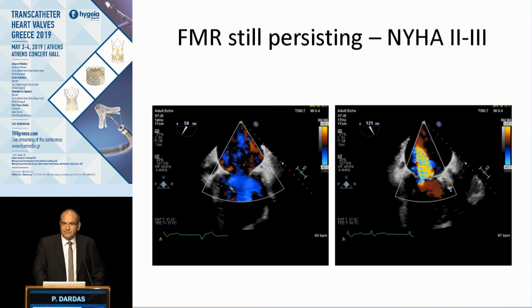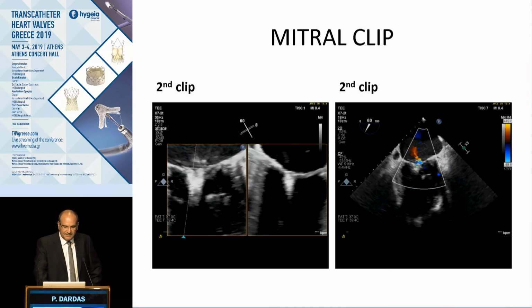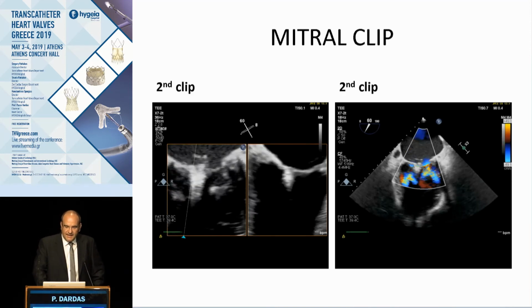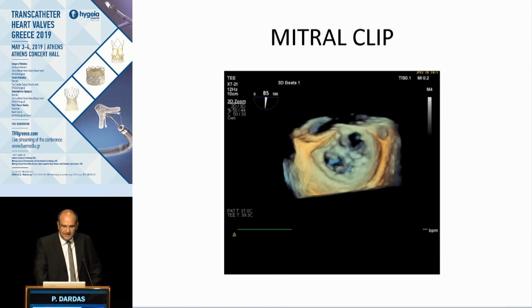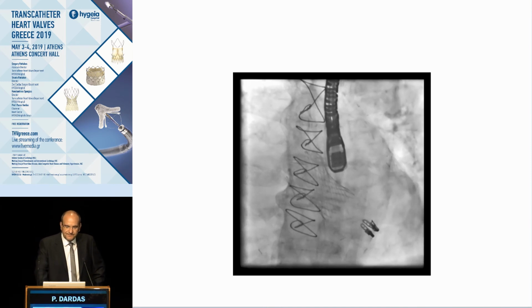So he had to come down to the cath lab very soon after the first procedure and receive 2 mitral clips with a very good result. And this was the final appearance. And this was the angiographic appearance.